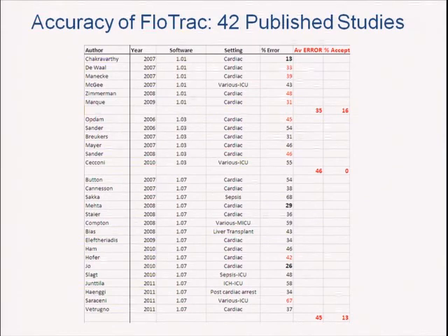I haven't invented this data. So there are 42 studies published, and as you'll see, what's happened is the first iteration of the device the performance was less than stellar, so the company came out with a newer software version, which again wasn't too stellar. They then came out with a newer version to correct the problems of the previous two versions.